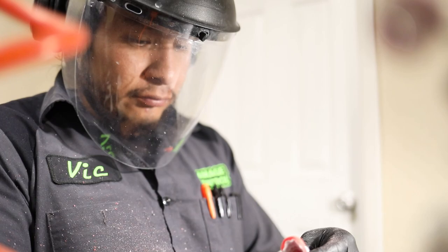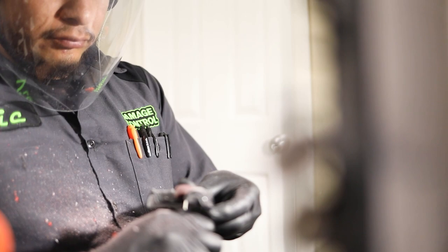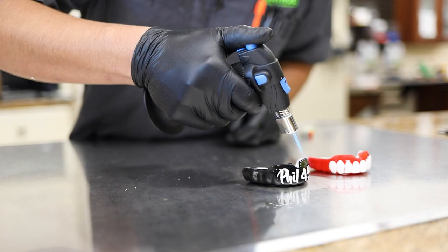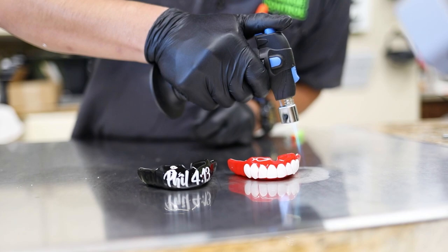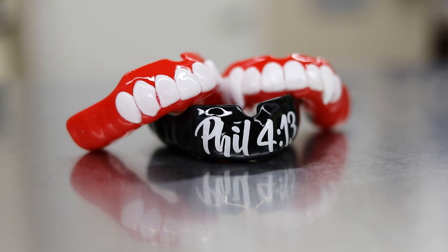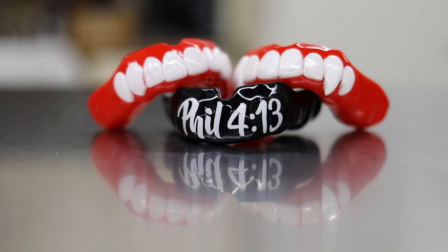So as we say, Jon Jones is the GOAT of MMA. I would say Vic is the GOAT of fabricating custom fit mouthguards. So this is the final stage, and we use a blowtorch to shine them up some. Shining up all the edges where he brushed it. And that's how you make mouth guards for the goat.